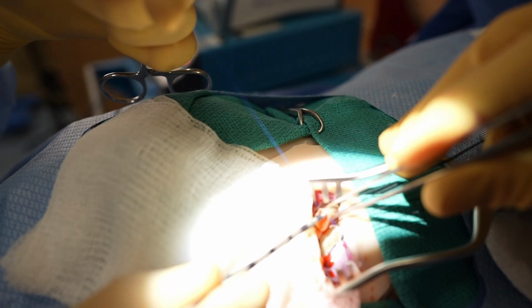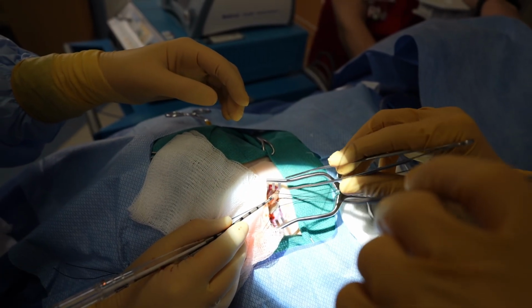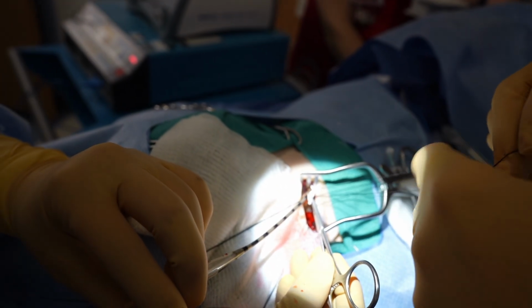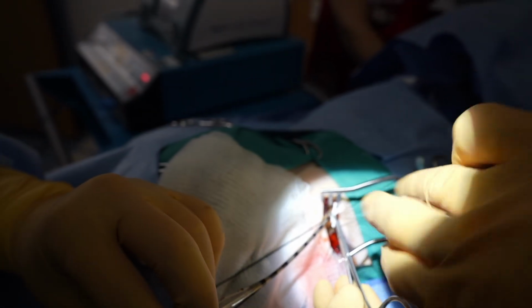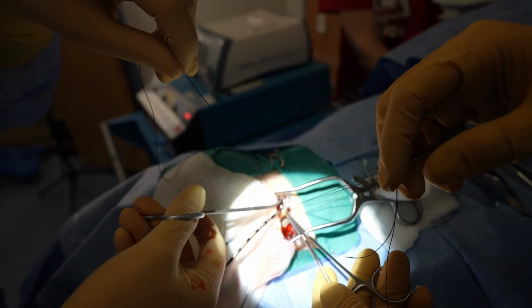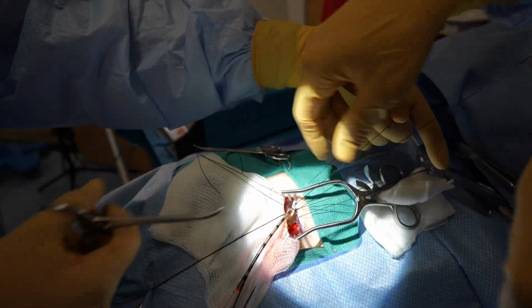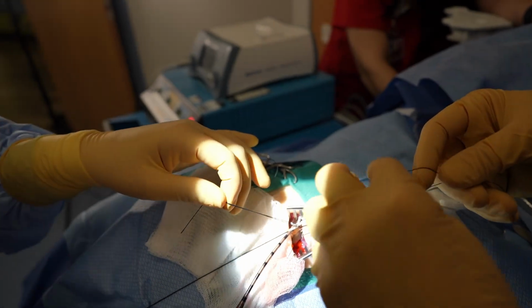After placing the cannula, we will have one of our surgeons hold onto the cannula while the other surgeon ties down one of our silk ties around 2 vessel loop bumpers on the cardiac side. The bumpers help to protect the vessel from necrosis from the ties and also help for ease of removing the ties when we are ready to decannulate. We place another silk tie around the cardiac side and tie it down for extra securing around the vessel loop bumper.